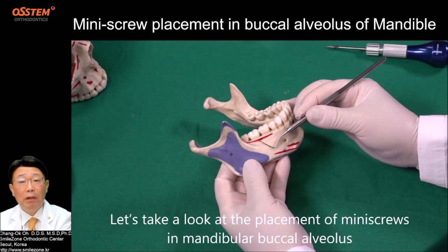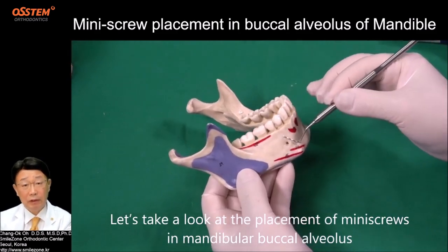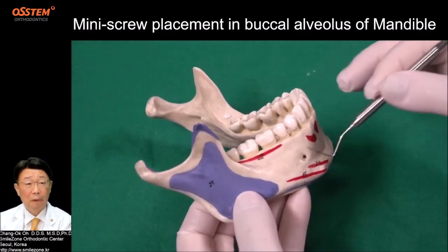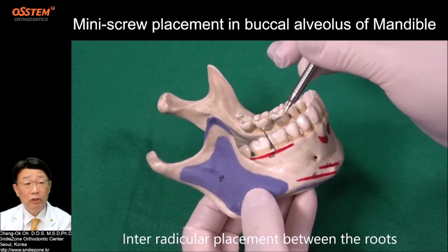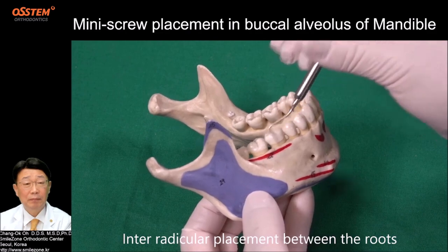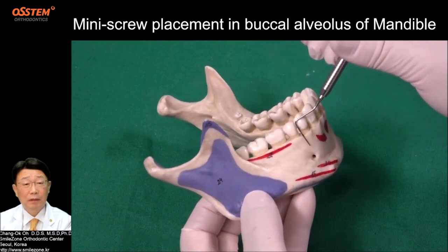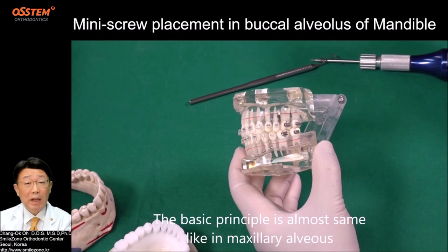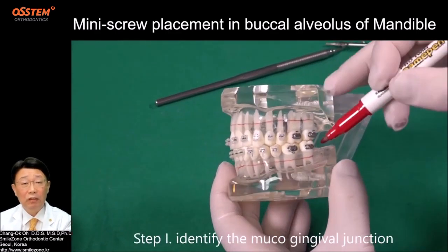Let's take a look at the placement of miniscrew in mandibular buccal alveolus — interradicular placement between the roots. The basic principle is almost the same as in the maxillary alveolus.